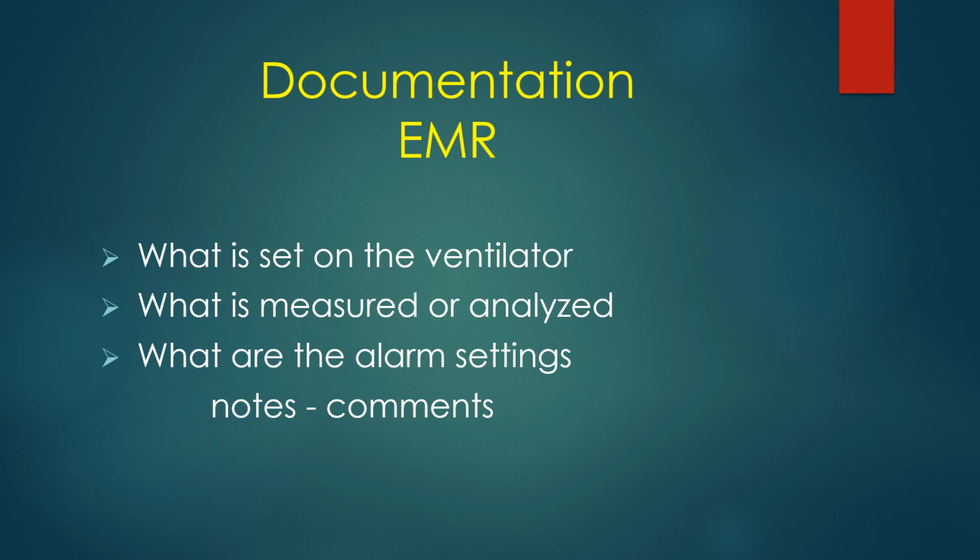So you can write a dear doctor note that the patient is still on assist control, and you think that he could start reducing his ventilatory support because he's getting a lot better, and move toward getting him extubated. Or that you note that he might need more ventilatory support. He might be better off with a different mode of ventilation. Any kind of things like that. That's real important for you to note.